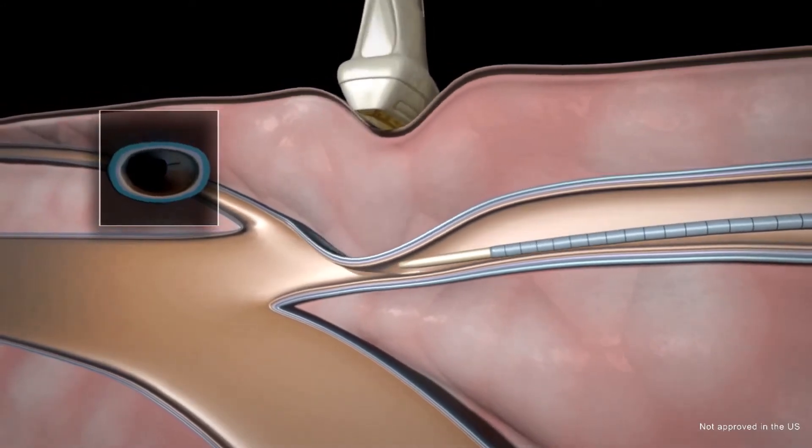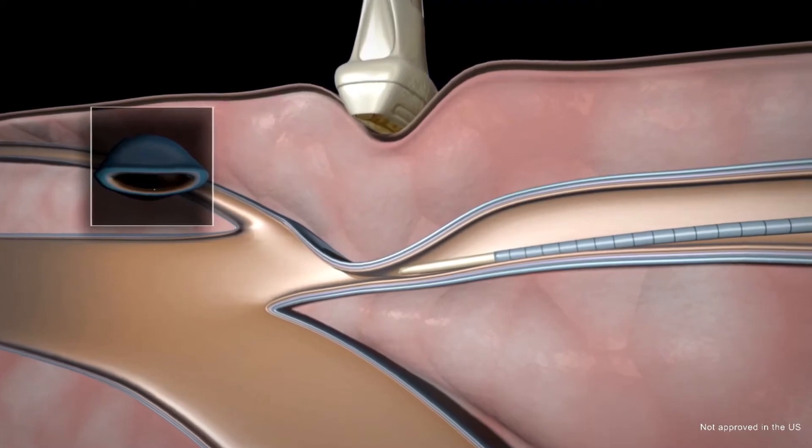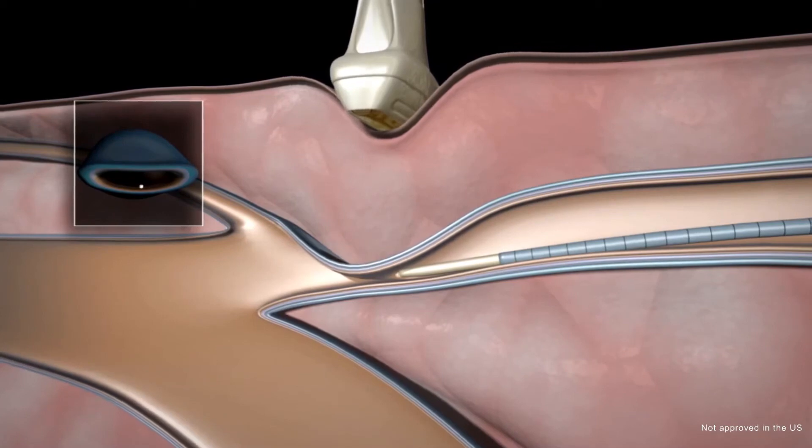Compression is applied with the ultrasound transducer above the catheter in order to coapt the vein. The first injection of the adhesive is then precisely administered.